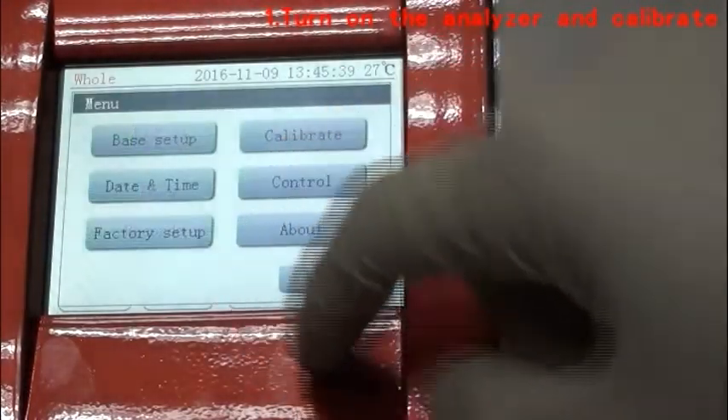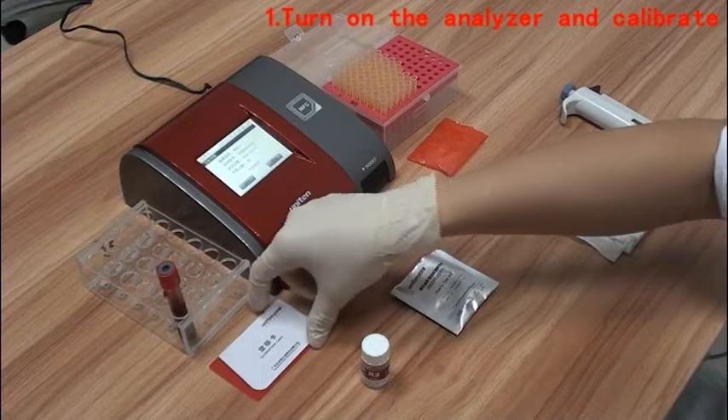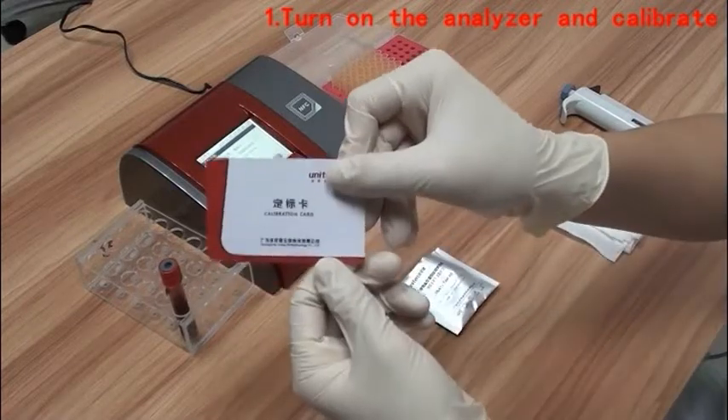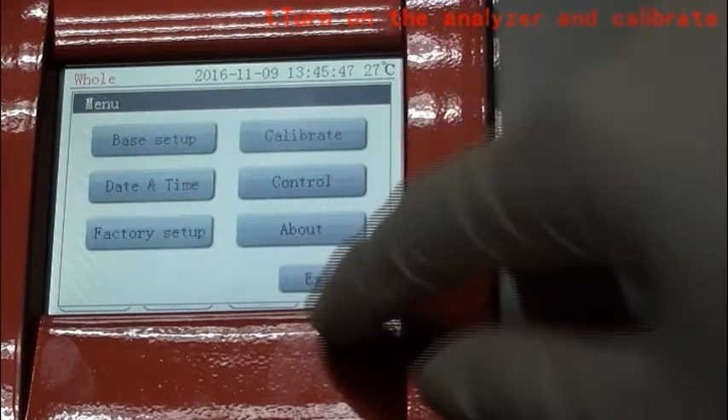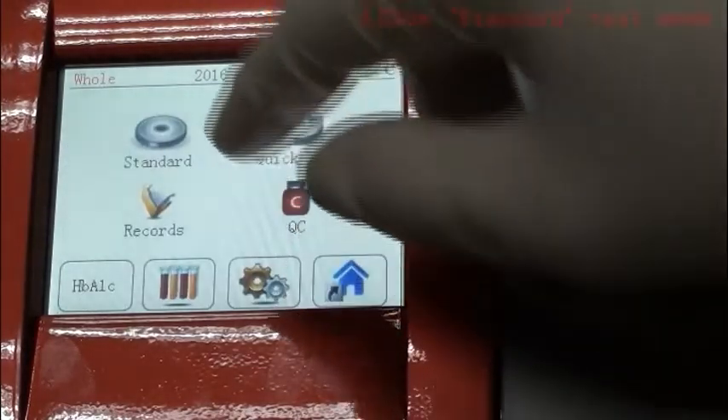Turn on the analyzer and calibrate: click the setup option and then click calibrate. Place the NFC card on the analyzer and a beep will sound when calibration is successful. Calibration parameters will be displayed on the screen. Click standard test mode.